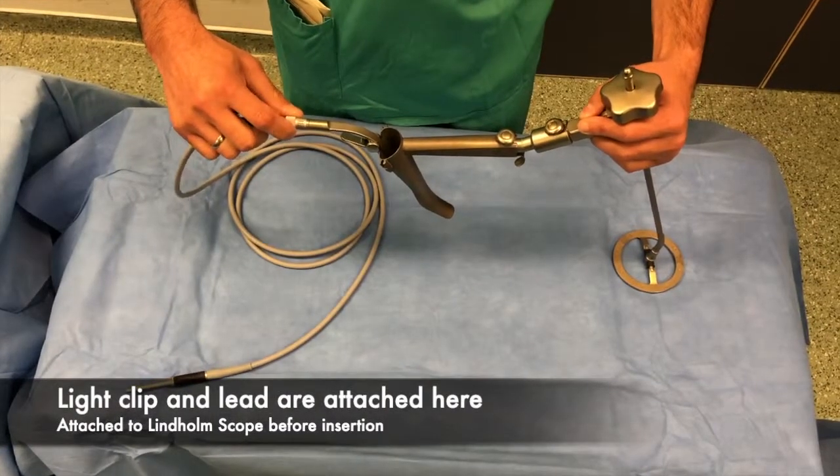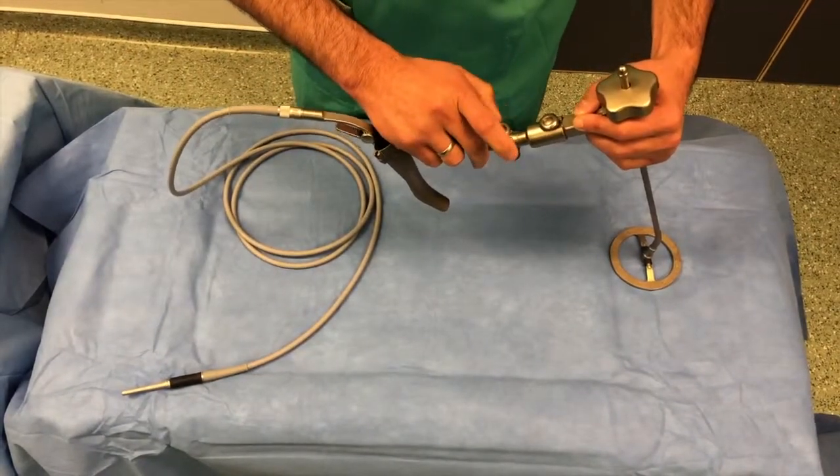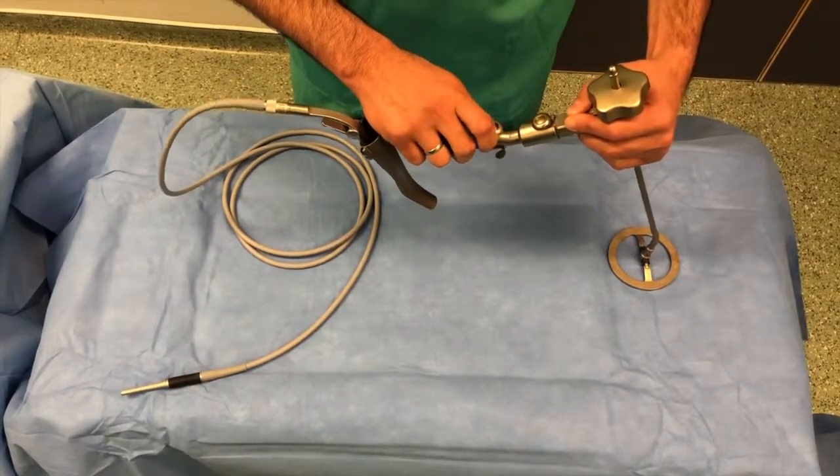Before inserting the Lindholm scope into the patient, a light lead and clip is attached as shown here. It can then be attached to the suspension.